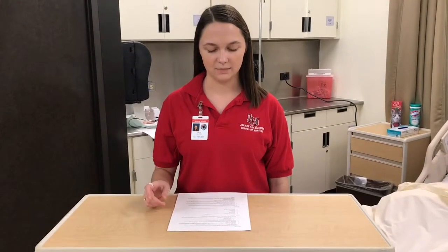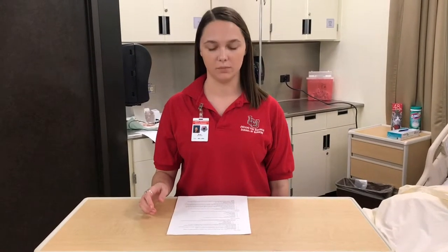Today we are going to be talking about a 24-hour urine specimen collection. This is a clean procedure and gives us a way to measure the concentration or dilution of the urine. It can also show us if there's any amino acids, creatinine, hormones, or glucose present in the urine. This test basically shows us the generalized characteristics of the urine over a 24-hour period.